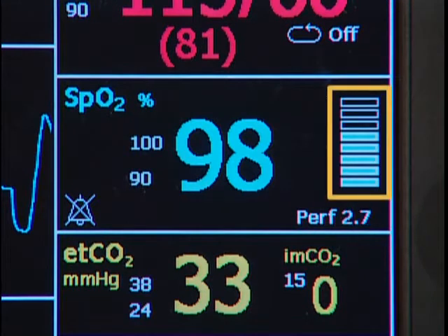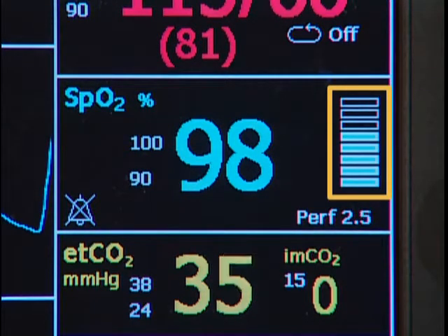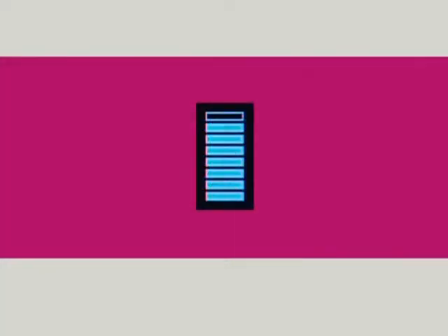This is the perfusion indicator bar. It is a signal quality indicator for the SpO2 measurement. A signal that fills five or more segments is considered optimal. If the indicator reads anything less than three segments, a new site should be selected.